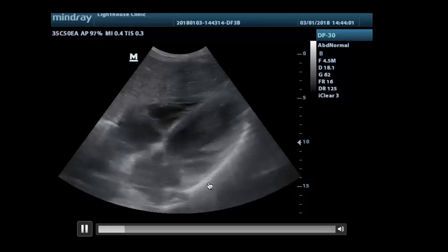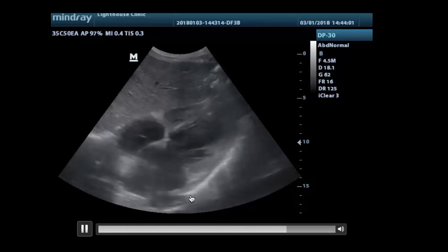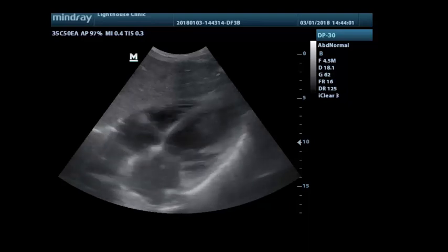And then in the back we see the echogenic line, that's the air of the lung adjacent to the heart. So that is the anatomy of the normal heart from a subxiphoidal view, and that one we need to be sure that we understand first.